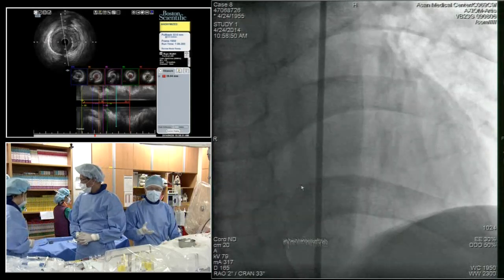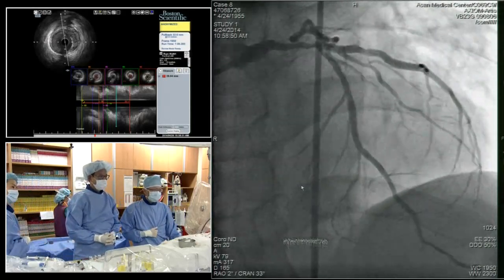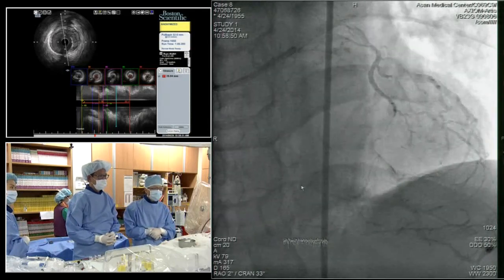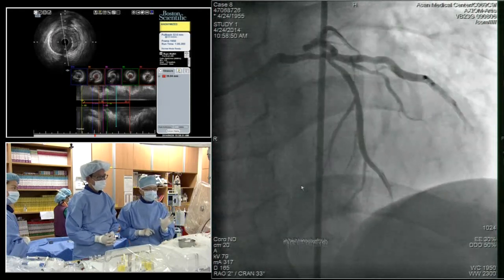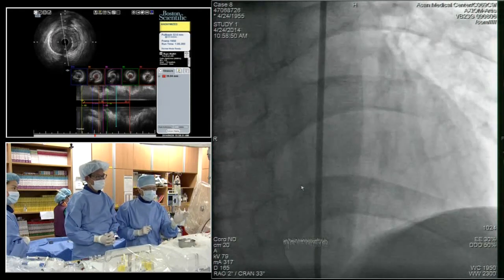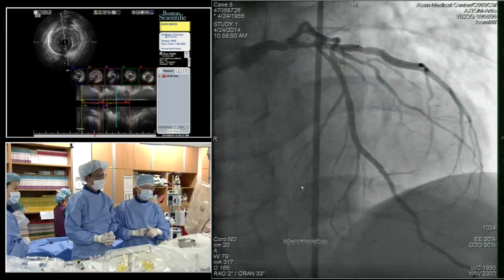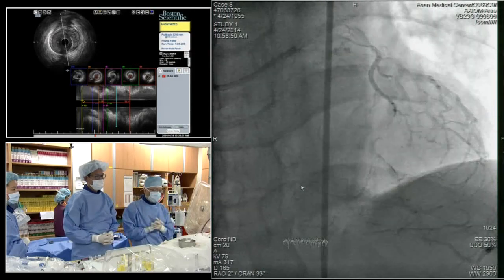Yeah. I mean, the one thing you don't want to do, if you're going to use 2 stents, is leave the stent near the origin of the trifurcation. So you want to make sure that you bring your first stent back into the left main. Right. So if I'm going to use 2 stents, I would cover from left main to LAD and put a distal one in, because once we put a stent, it should be okay to just add to the edge. But hopefully we can land it with one stent.